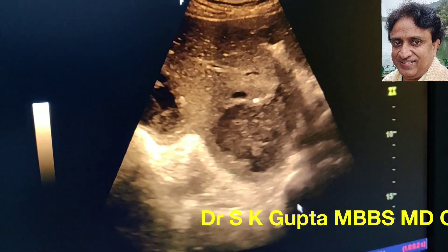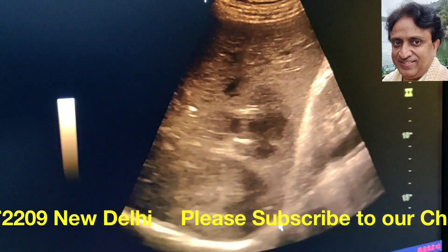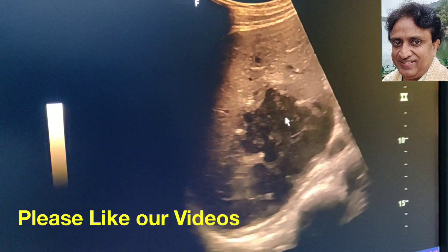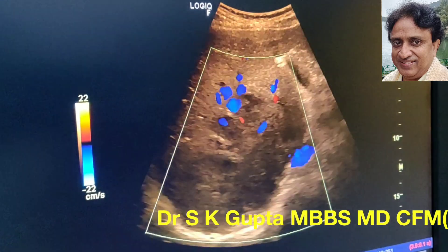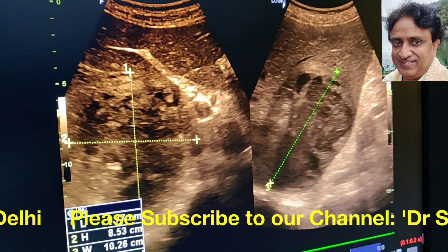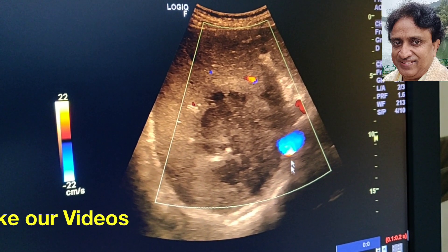This is another case of liver abscess where you can see multiple abscesses — one here, another here, and a third over here. There are multiple irregular liver abscesses; the biggest is in the posterior superior segment. On Doppler, the abscess is poorly vascular and shows no vascularity. You can see the portal circulation, intrahepatic biliary radicles, and portal veins along the liver. The largest abscess measured around 500 ml, with additional smaller abscesses present.